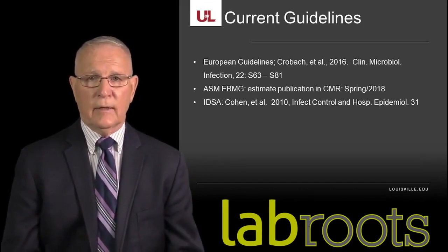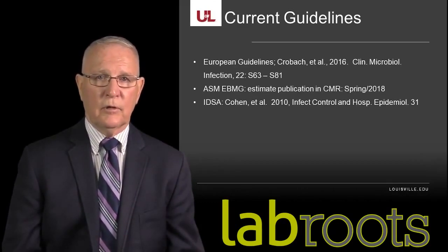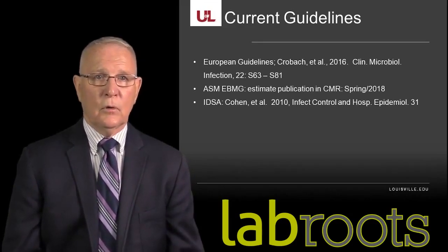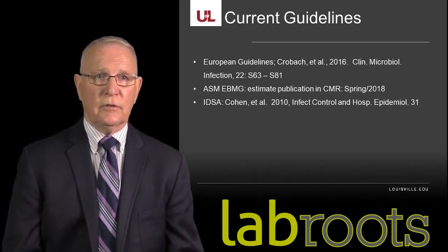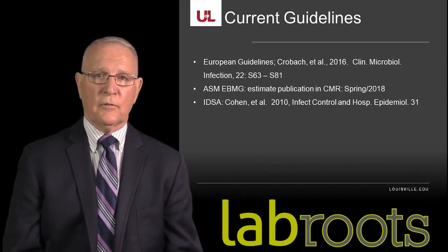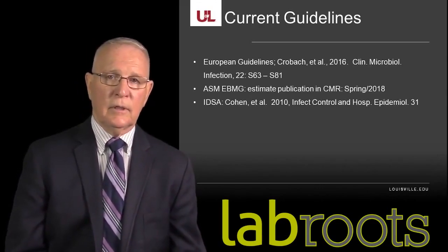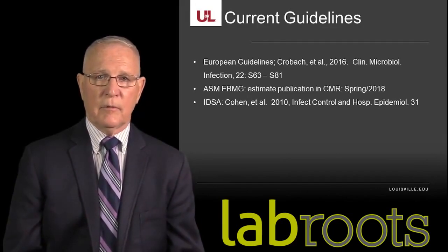The European guidelines advocate a 2-step or 3-step approach, with PCR being used either in the 2-step or as confirmatory testing. In other words, as part of the 2-step, some laboratories will do the PCR first, and if the PCR is positive, then they will flex to a toxin assay, usually an enzyme immunoassay.